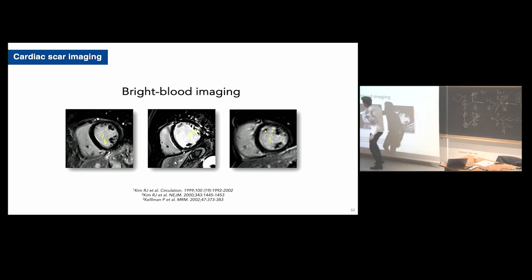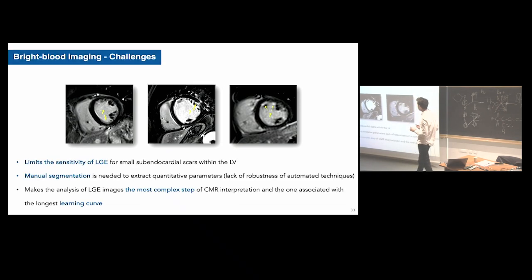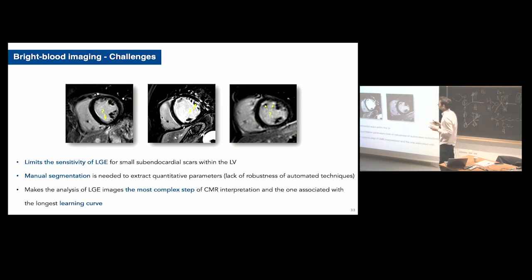Same there. Look at this kind of hyperenhancement here, but it's not so obvious. Isn't it motion artifact, as we saw on the cine images before? This impacts 15% of the population in Marseille, in Bordeaux, in New York. We all use the same technology, so we all have the same problem. And this really impacts not only the diagnosis, sometimes we don't know what to say for this patient, but also the segmentation. If we don't even agree on the visual aspect of the scar, how can you segment this scar? So this is really complicated.